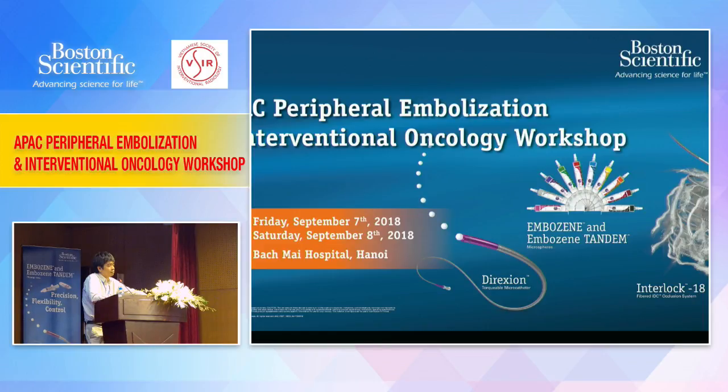Don't try to push so much, because we can check again. It's going to be slowly embolized later on. Don't try to push a lot of absolute alcohol at one time, because it's going to go back retrograde to the other normal area and close up the normal area. So I think so. And for the follow-up, what is your experience?